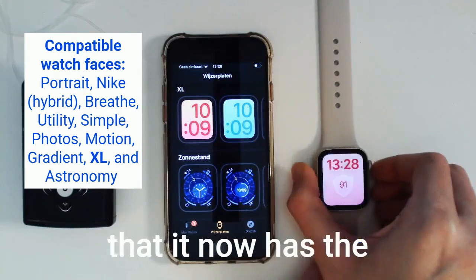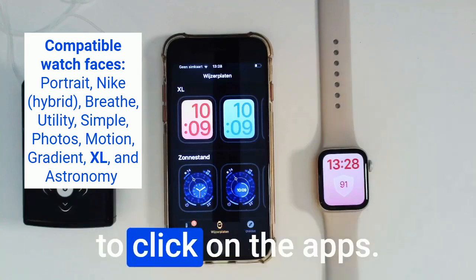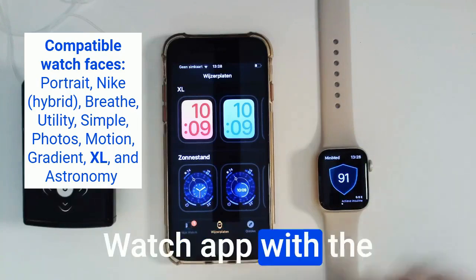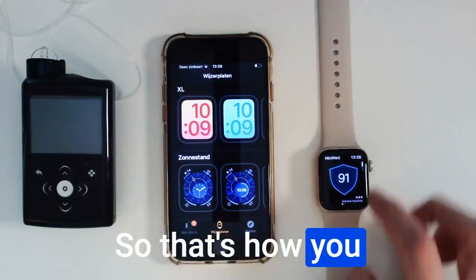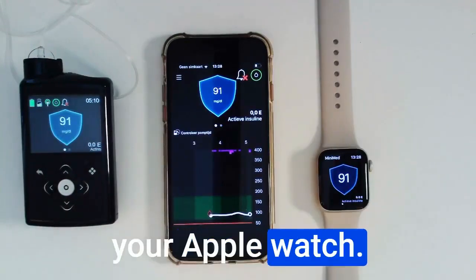If you add the watch face to your Apple Watch, you can see that it now has the sensor glycemia and the SmartGuard shield on the watch face without having to click on the apps. If you click on this complication, you have access to the regular MiniMed Watch app with the sensor graph and the time in range. So that's how you make the link between your MiniMed 780G pump, your MiniMed Mobile app, and your Apple Watch. Good luck!